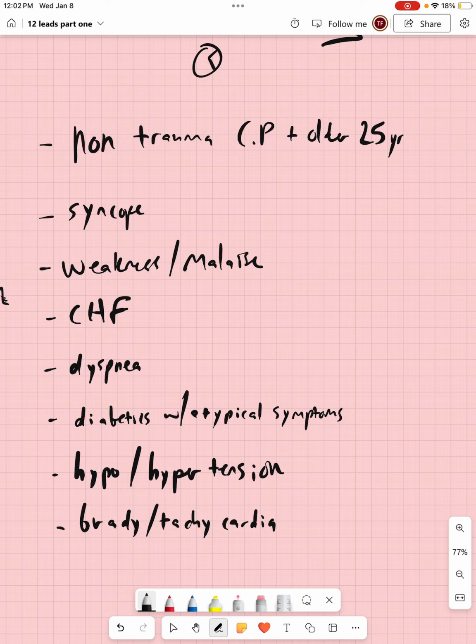That's great that we're doing a 12 lead, and it's great if we can read the 12 lead, but we are not the doctor and we're not the cardiologist. We're not the specialty care team that is in place for this patient. After we're done with them, they're the ones who need to see this information most. When we transmit that 12 lead, very often it is sent immediately to cardiologists and cath labs, and doctors start doing things right away.